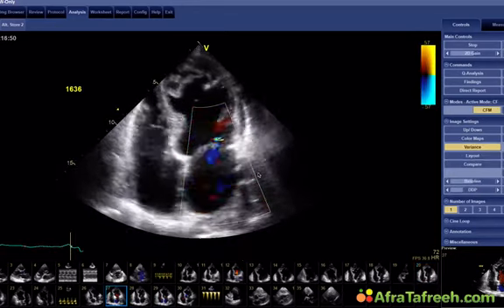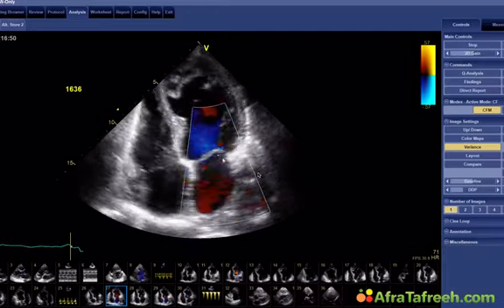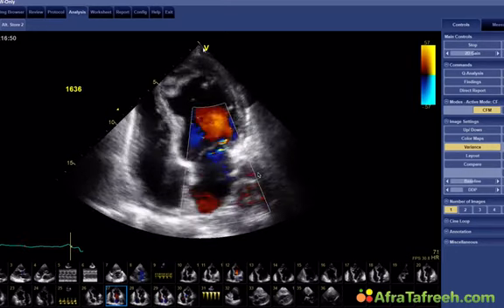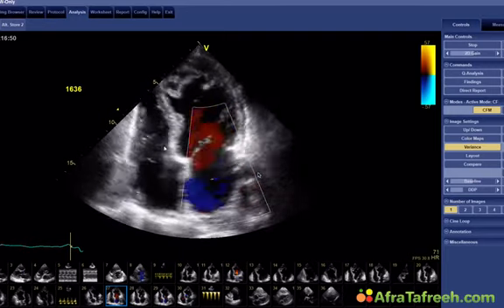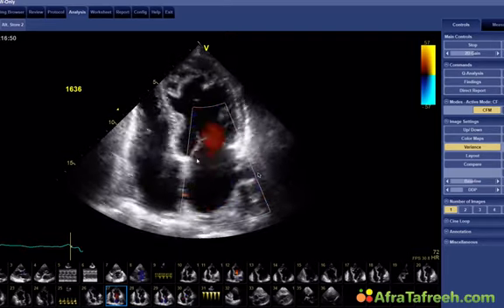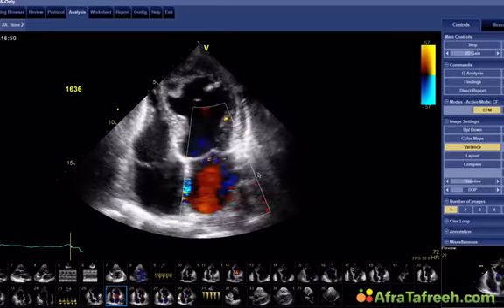She needed diuretics. She was in pulmonary edema. There's not very much mitral regurgitation. Now you will ask why, even though the ventricle is so large. The reason is simple, because the basal parts of the left ventricle are not very dilated. That's why there is not much annular dilatation, and therefore not very much mitral regurgitation.